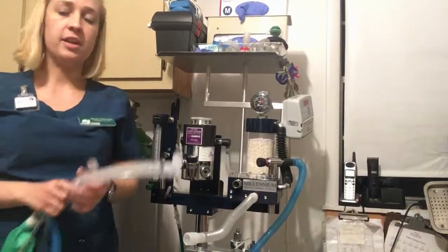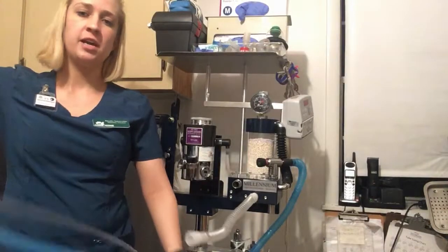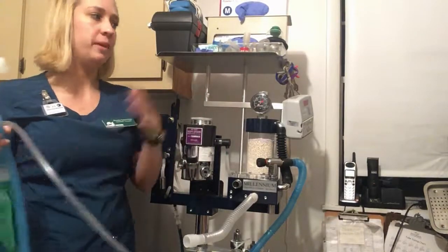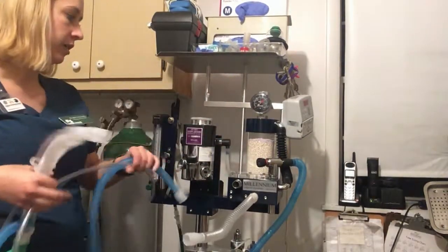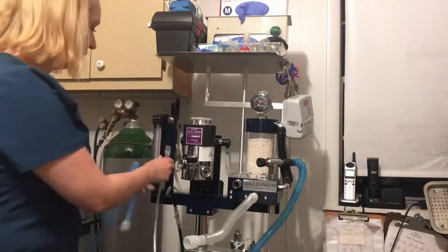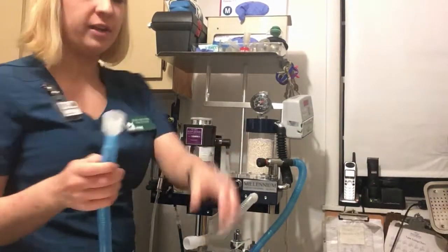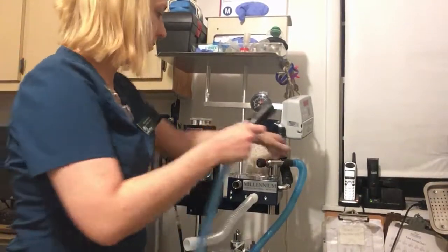So the other circuit that we will use is a non-rebreathing circuit. This will be used for your smaller patients that don't have enough exhaled airflow pressure to really get the air moving through the system. The way that you're going to attach this one is to the oxygen, and then this will be directly attached to the scavenging system.